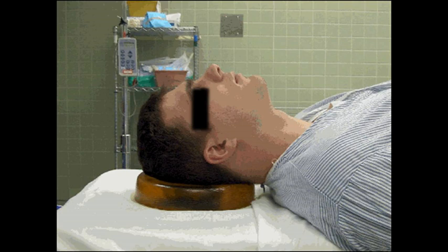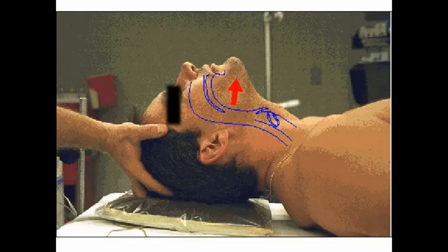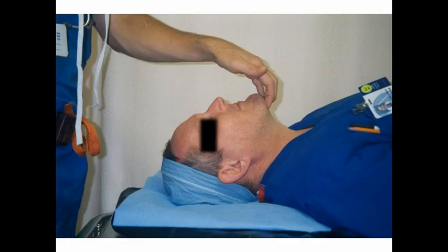Now recall that in the previous presentation on manual ventilation, we used a series of maneuvers to open the airway so that gas could flow from the patient's mouth into their lungs. These maneuvers will successfully open the airway enough for gas to flow down the airway. So let's think about this.